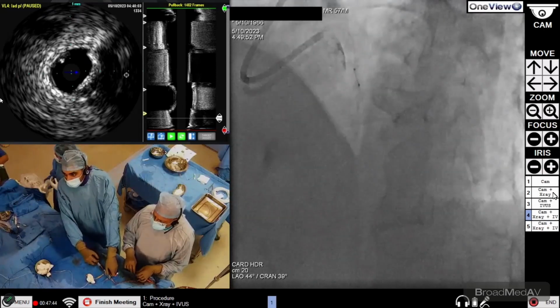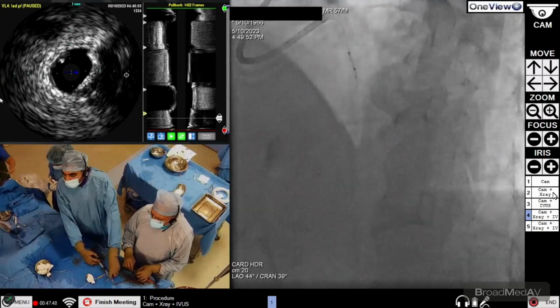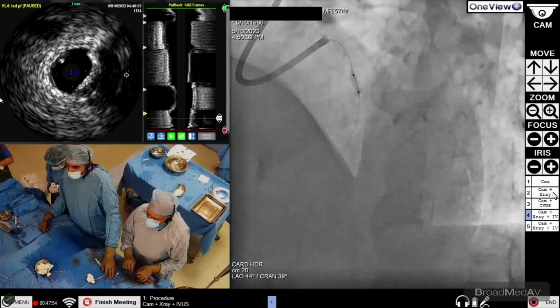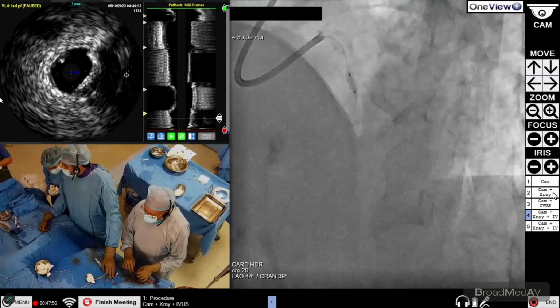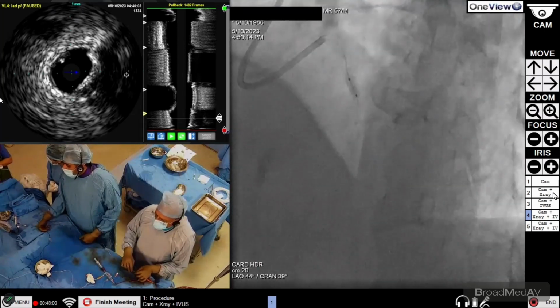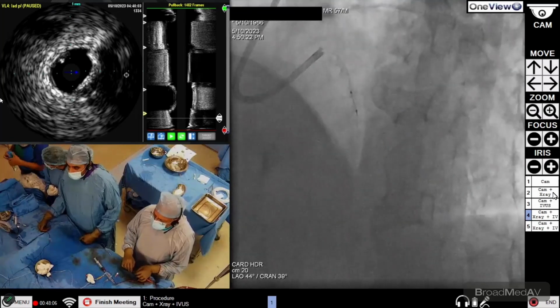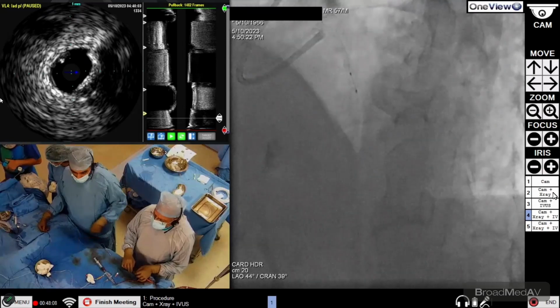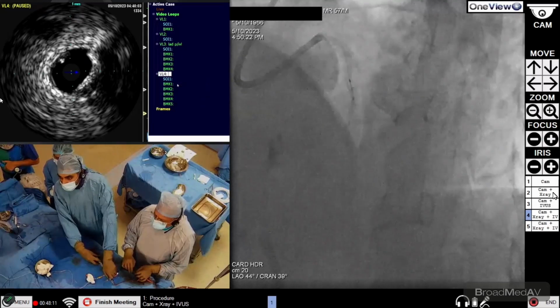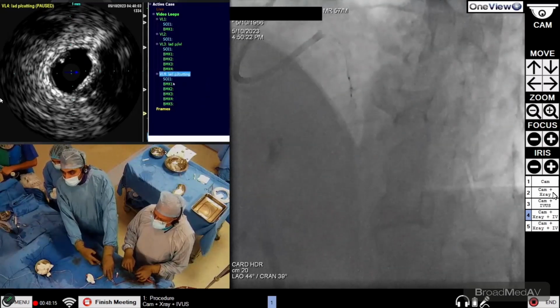Okay, please. Okay. Go up. 1, 2, 3, 4, 5, 6, 7, 8, 9, 10, 12, 14. Deflate. So we go to high pressures here also. Check please, where are we? Okay, 1, 2, 3, 4, 5, 6, 7, 8, 9, 10, 12. Deflate.